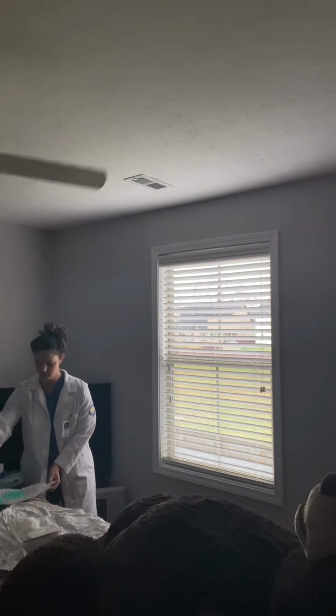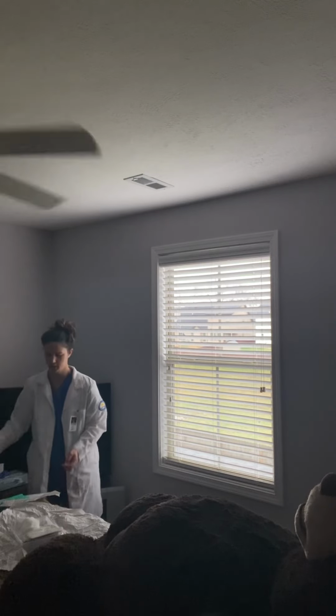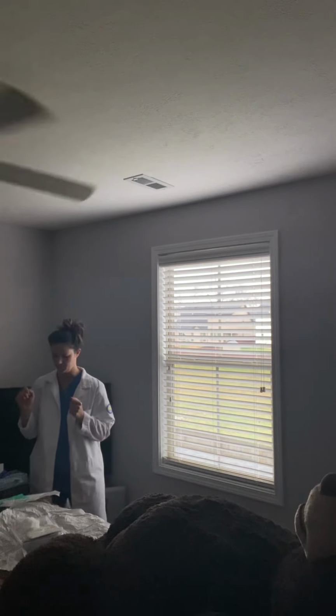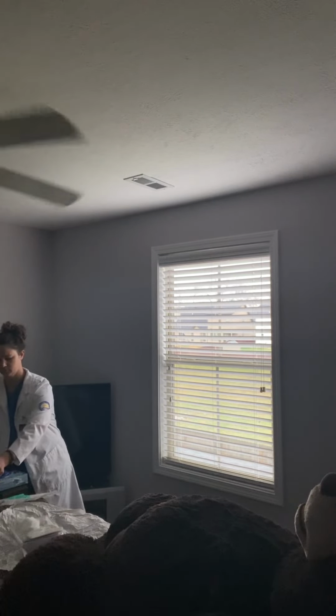All right, and you've got your borders here that you want to make sure that you're not touching the inside. Pull that open. All right. So I'm right-handed, so I'm gonna put my right one on first. So I'm just gonna grab, make sure that doesn't contaminate, touch your hand. It's gonna flap over anyway.